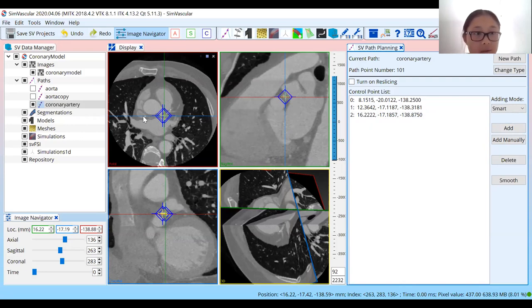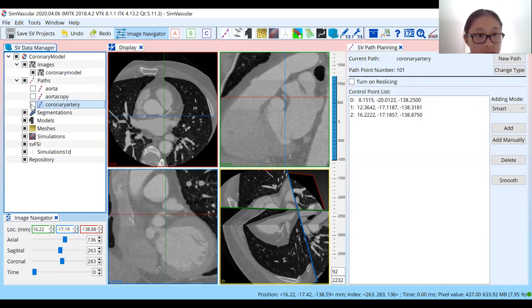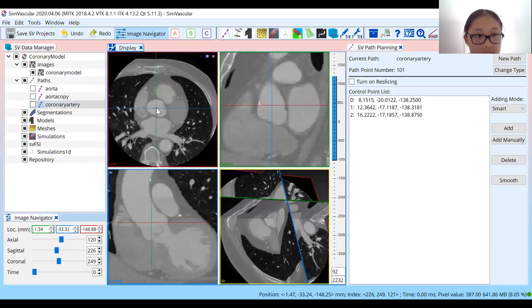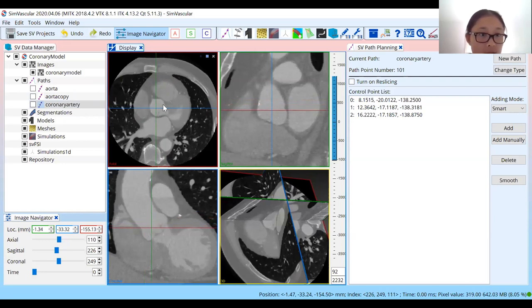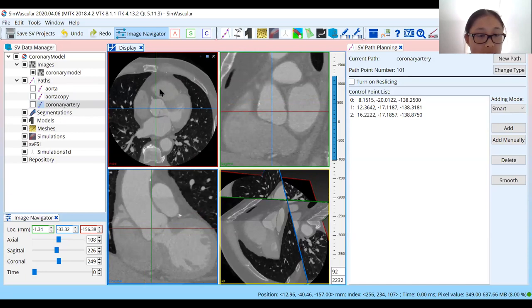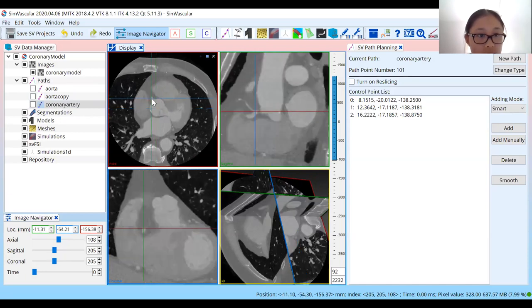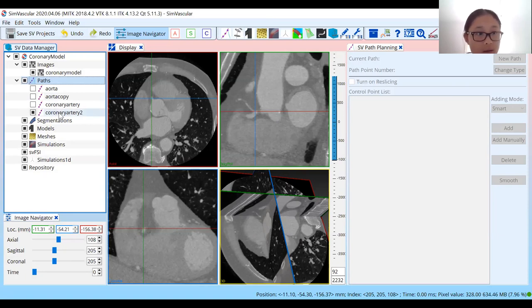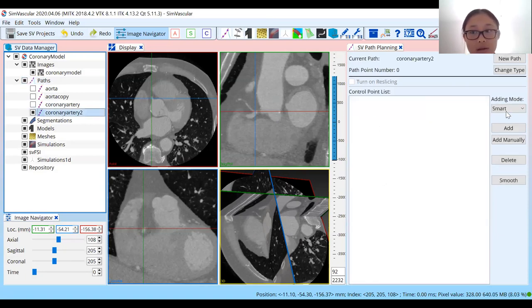Let's go back and see if we can find the other coronary. I'll turn off this one so it's not obstructing our view, and go back to the center. This time we're looking for something coming off the other side of the aorta. Right about here you'll see that something is coming off the aorta, so bring your crosshairs there. Make sure again to start a new path — create path — and you can name it "coronary artery 2" for now, or whatever you'd like. Then select it to make sure we're adding points to that path, and then click Add.